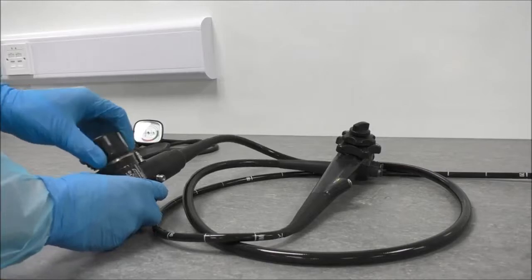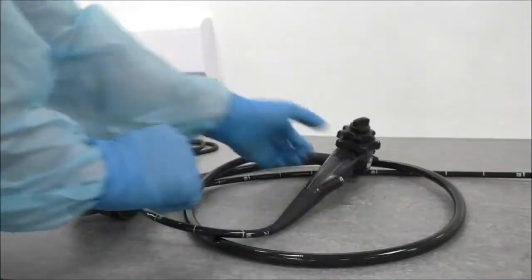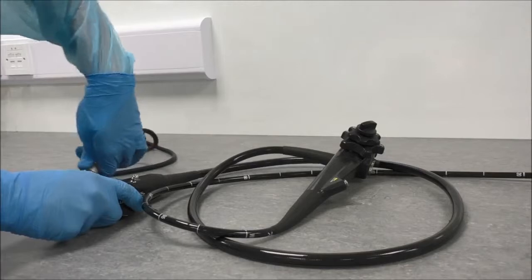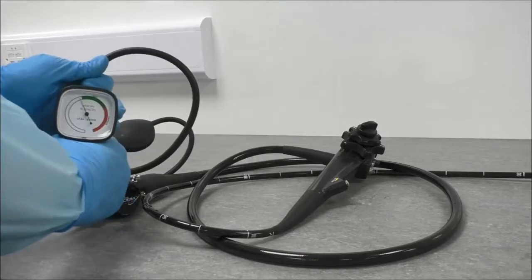Next stage is the leak test. Attach the water resistant cap, remove the endoscope's accessories, and attach the leak tester. Once connected, pressurize the scope to recommended specifications.